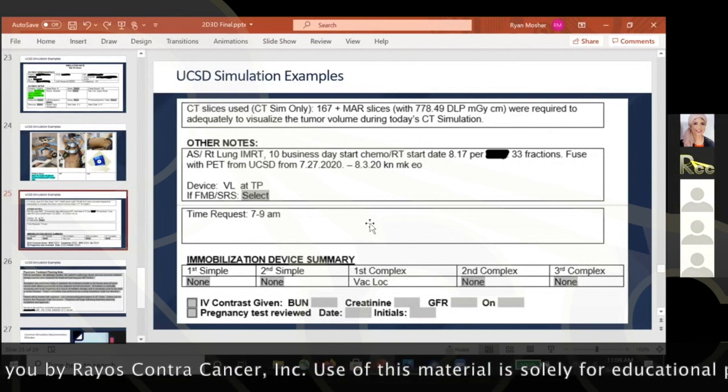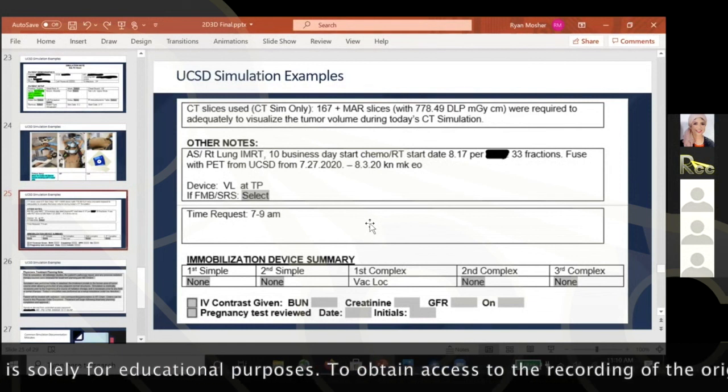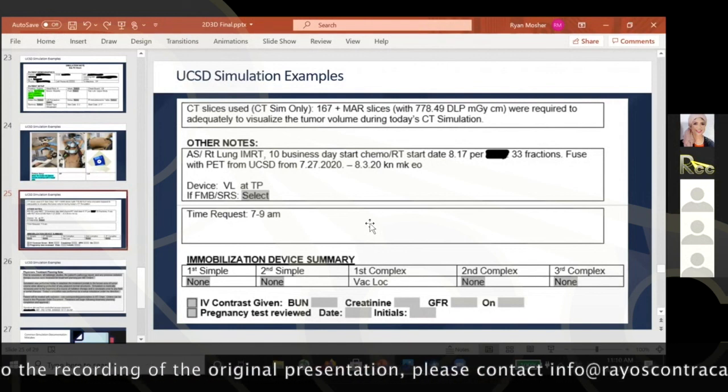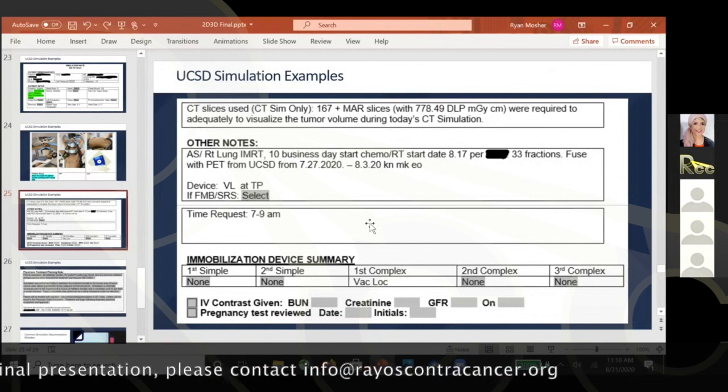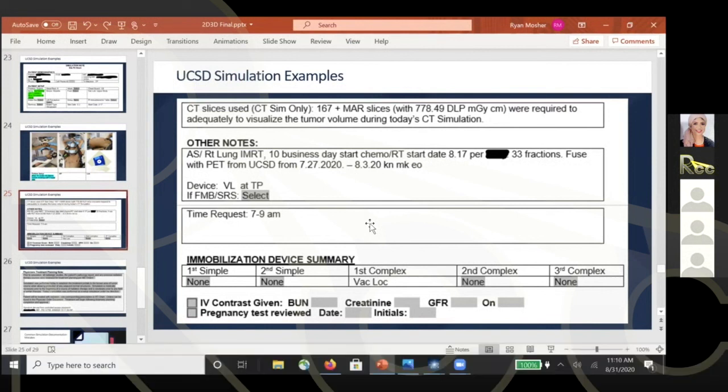Why are you not using a breast bra for pendulous breast in supine position? We use it in our center. What was the question again? In pendulous breast, large breast, if we treat it in supine position, we use a special bra for fixation. Yeah, there have been a few doctors in my clinic that have used bras as well. It's rare, but I think the bra is fine, as long as there's no metal in it and the bra is stable, it can definitely keep the breast in the same position every day.